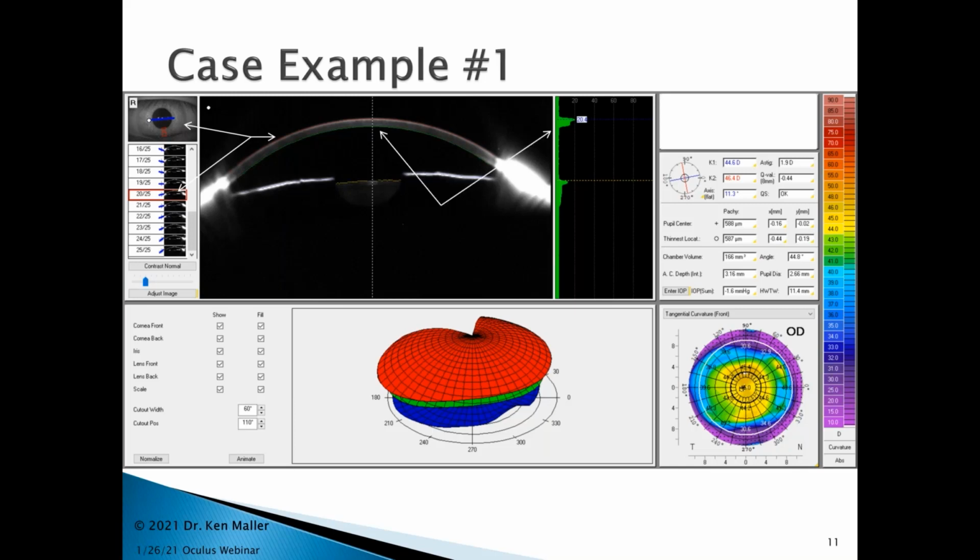Over here, you see that dotted line crossing through the visual axis, and on the right I have it pointed to that raised up green area. That is basically a transmission of light. Anything that interferes with light making its way through some particular surface registers on that green graph as something interfering with the light transferring through unencumbered. The higher that number goes and the higher that peak is on the green graph, the more opacified whatever structure the light is passing through.